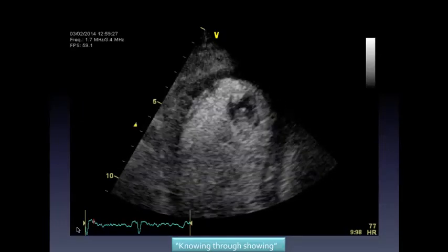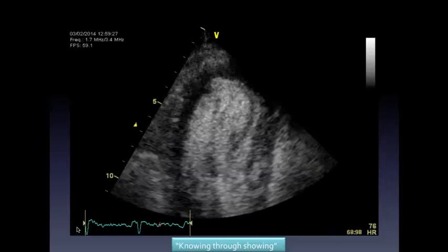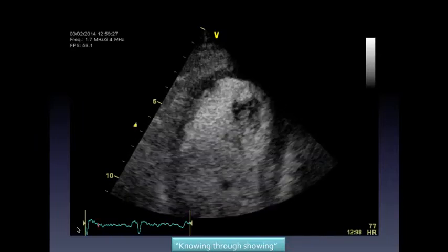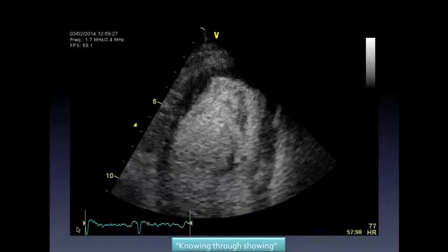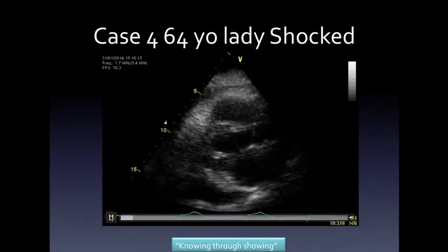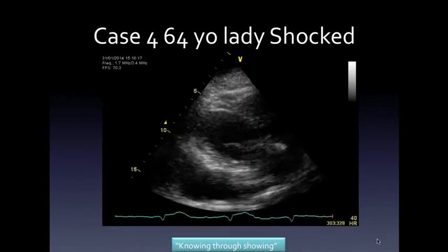Okay, so the contrast, I can't mention the trade name, the contrast saved the day there. Okay, there are some concerns about using contrast in acutely ill patients, but we found it very useful in this case to clarify the diagnosis. So just one more case, and we'll call it a day or morning. So just for the audience, any comments on that?